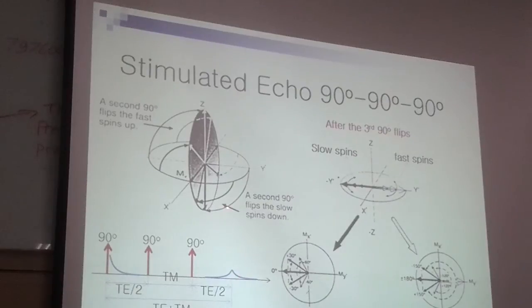So this spin diagram shows the state just after the second 90-degree RF pulse, as shown in the Hahn echo spin diagram. After that, all spins are refocused like this, the same as in the Hahn echo.